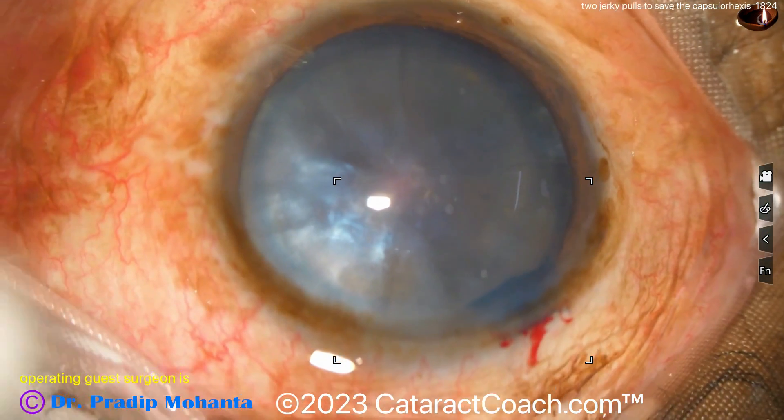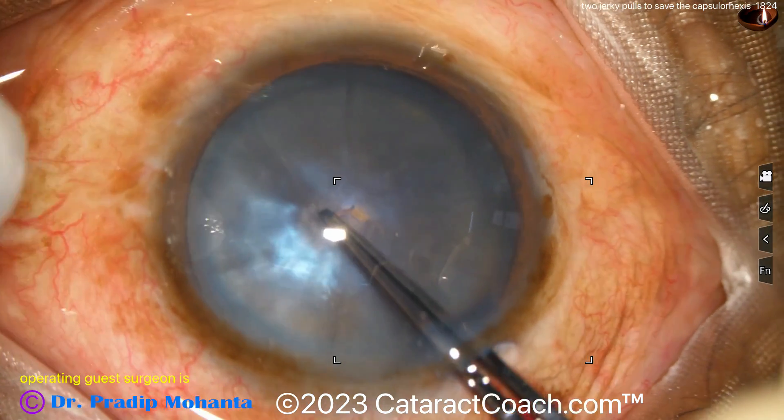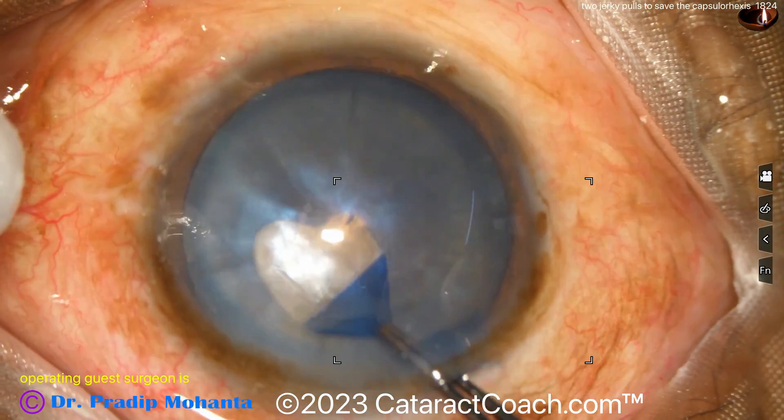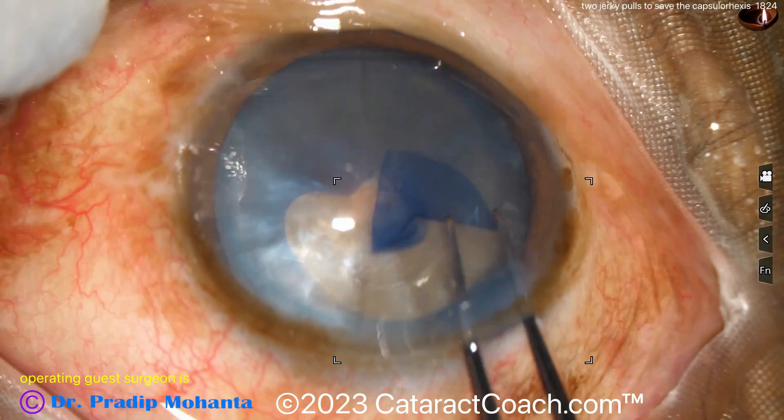You can see it's a very dense cataract, brunescent with some whitish features stained with trypan blue dye. Starting the rhexis here, grabbing the capsule, making a nice generous rhexis, but watch carefully as it goes around — it runs out.